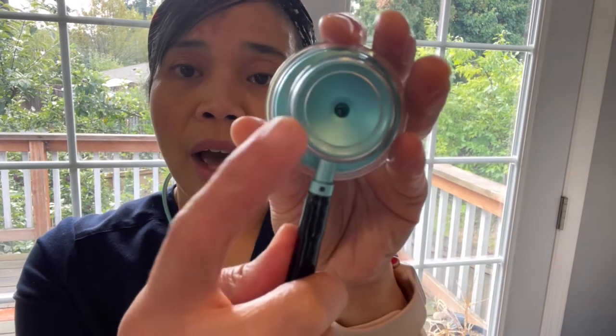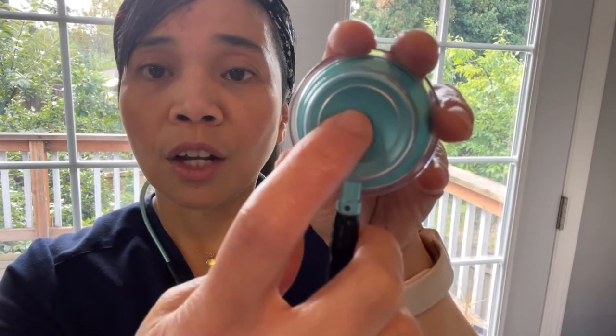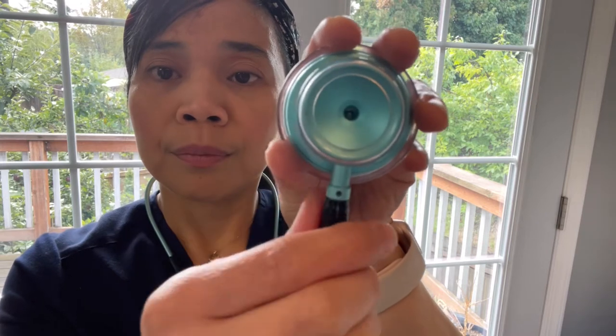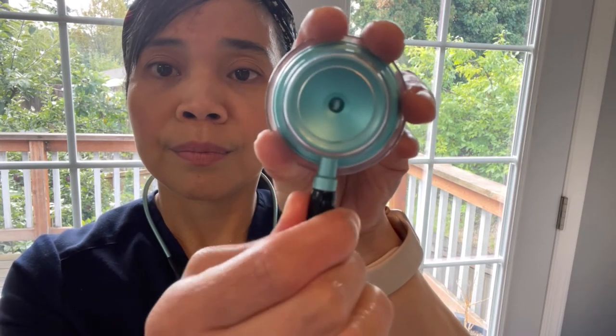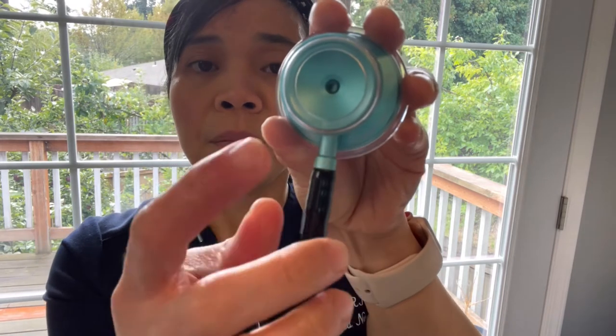To accurately listen to your adult patients using this side, make sure the bell is closed and the dot right here is twisted to the other side like this. So now it's closed and the dot is not showing, meaning this is the proper way to listen — this is the proper side that you will use to listen to your patient's lungs. Now I cannot tap it that hard because I'm going to be damaging my eardrums.